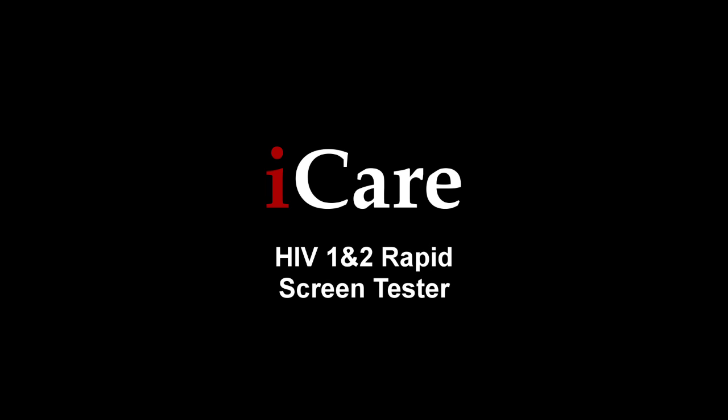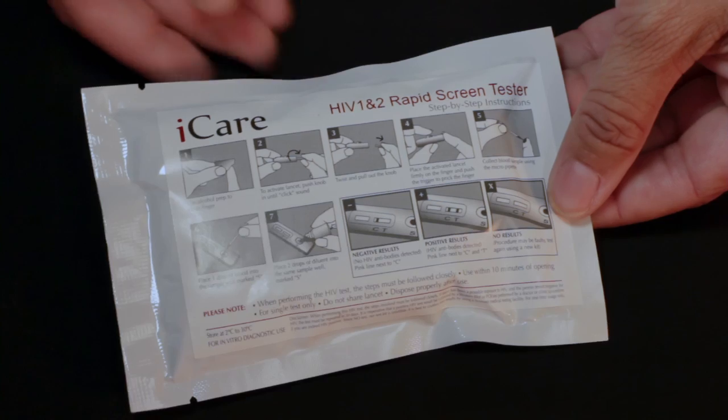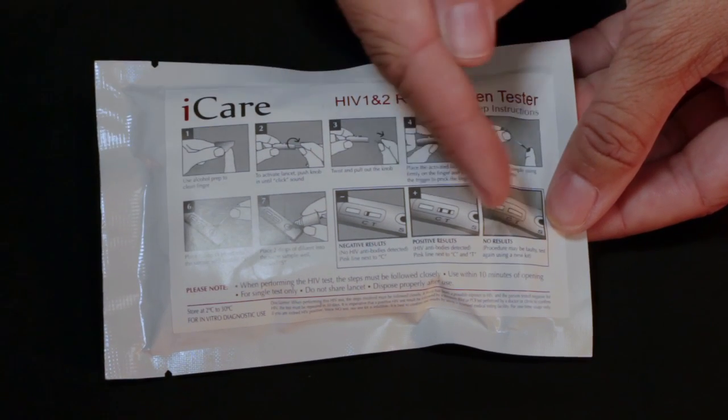Thank you for choosing the iCare HIV-1 and 2 Rapid Screen Tester. This video will demonstrate the proper way to use the tester for the best results. When performing this test, the steps must be followed closely. Detailed instructions can also be found on the back of the test package.